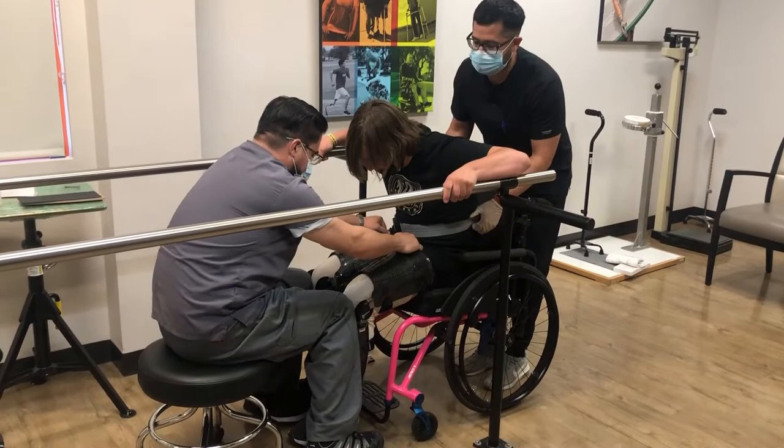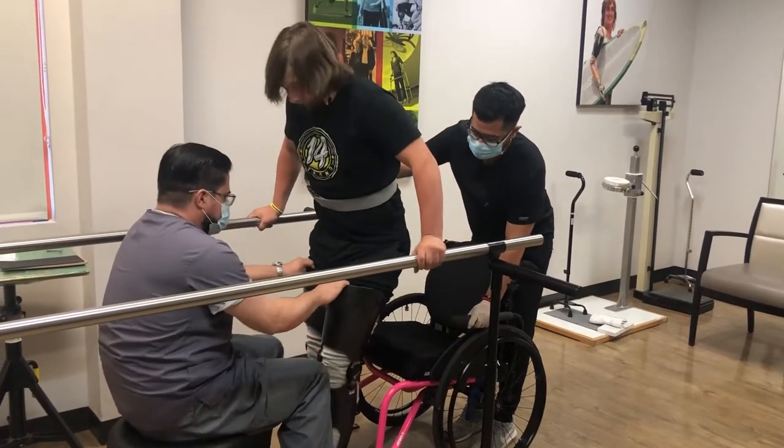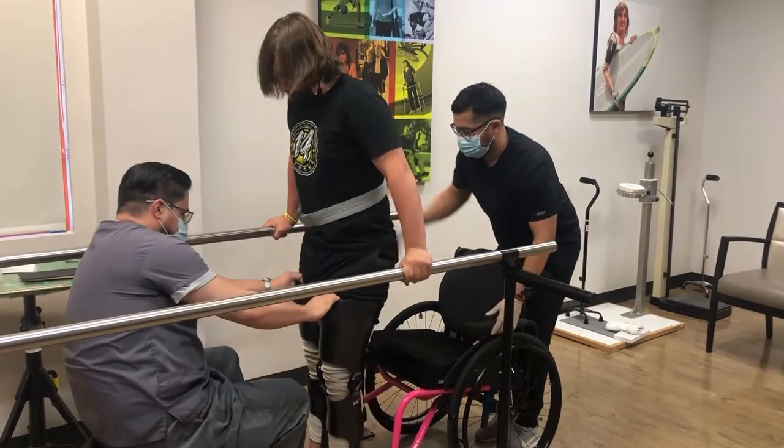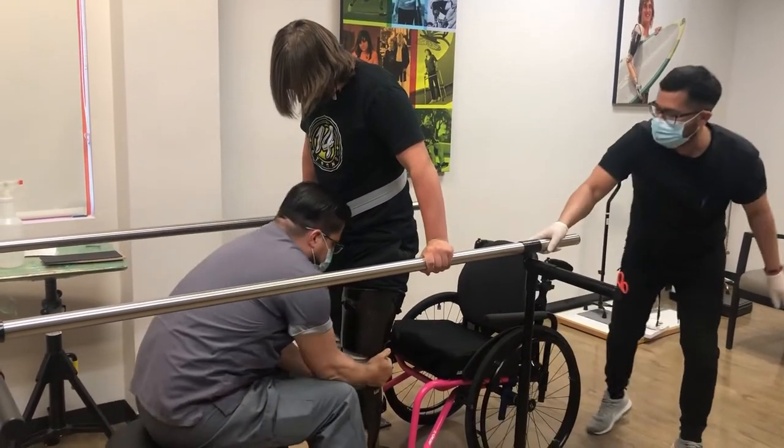Do you want to walk? I want to hold your knees. Alright, okay. I'm going to spread your knees — just one leg out. I don't know how to do that. Okay, let me help. I'll do it.